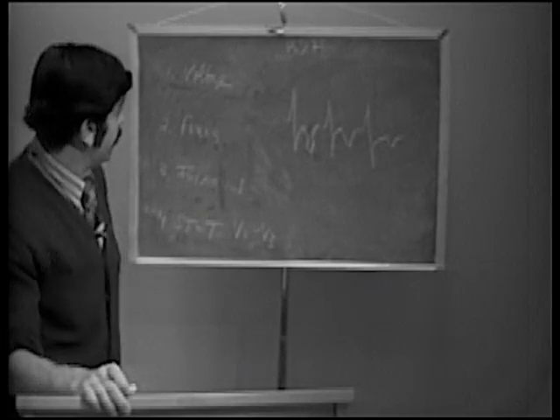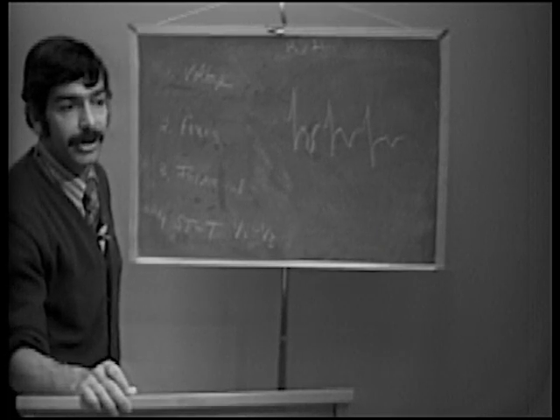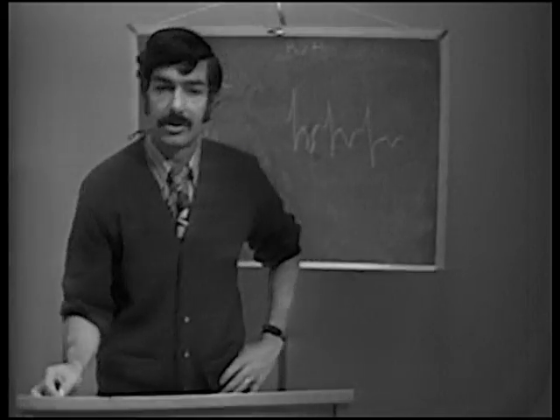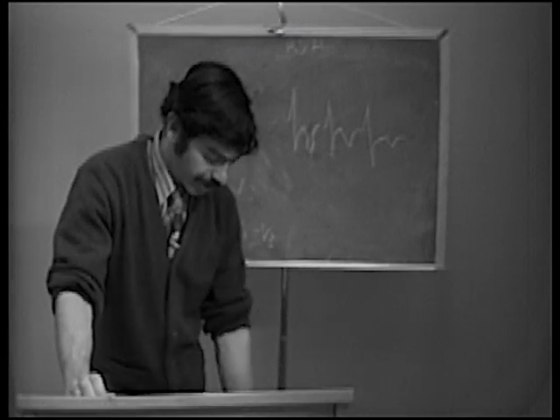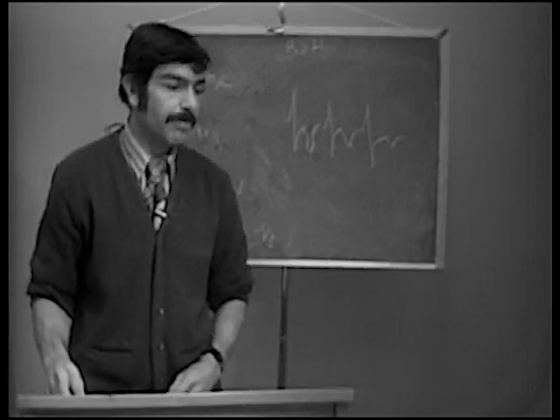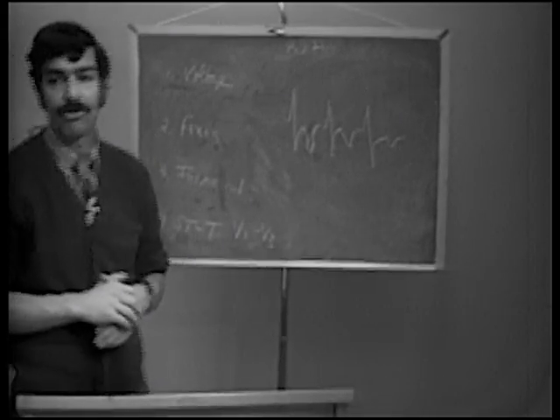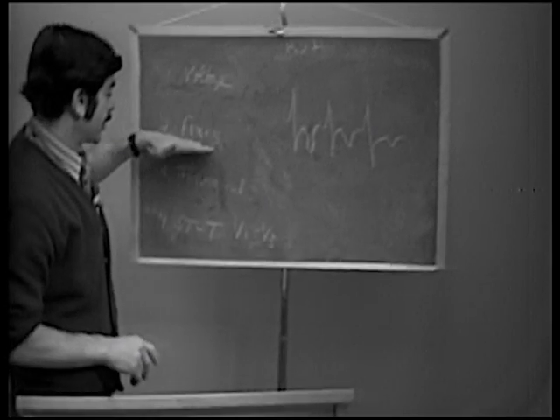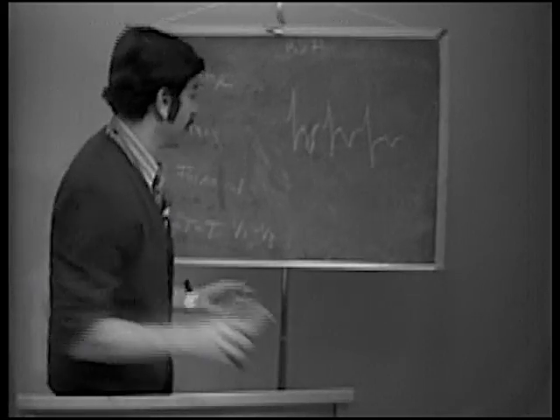Okay, is there anything else that I have to cover about RVH? Are there any questions then about RVH or ventricular hypertrophy in general, left ventricular hypertrophy or right ventricular hypertrophy? Okay, again, the important thing to keep in mind is this outline. If you keep this outline in mind, everything else will just fall into place. So just remember, always: voltage, axis, intrinsicoid deflection, ST-T wave changes, and then everything else will come from that.